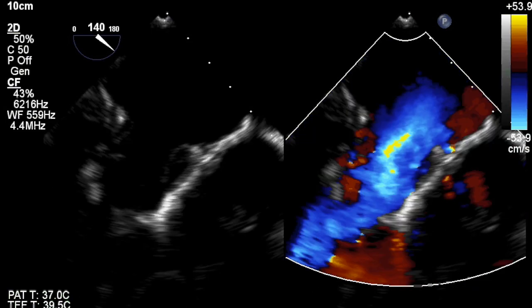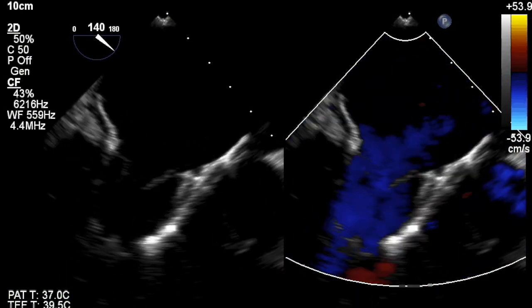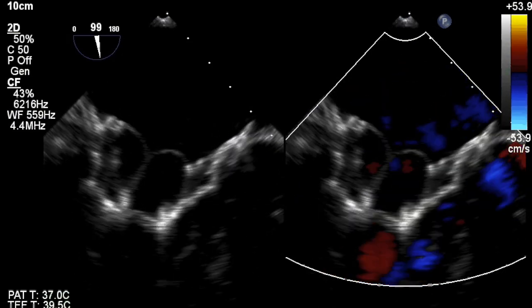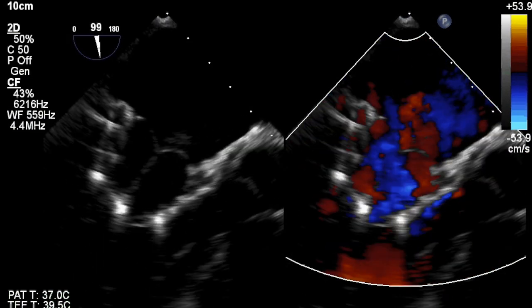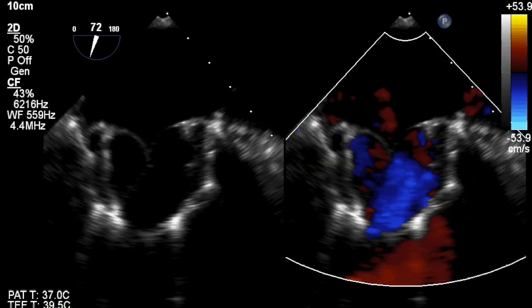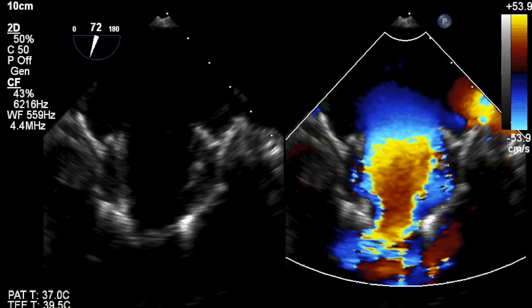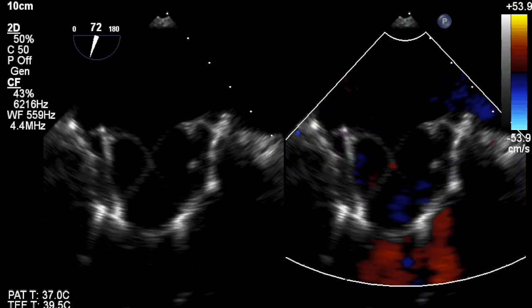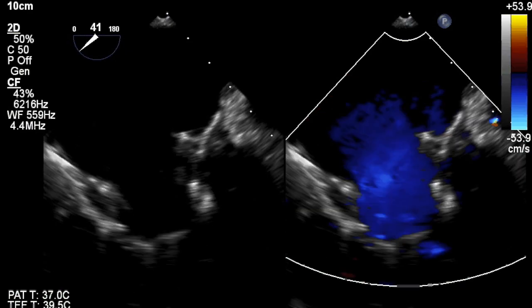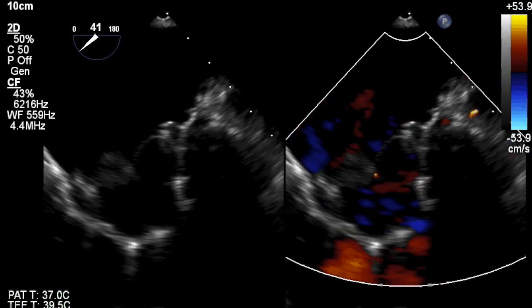During evaluation of the valve, the operators maintain a constant tether tension, holding the valve in place while completing the procedure. Color Doppler is used to evaluate for paravalvular regurgitation. The valve is observed to maintain its position and is not overriding the annulus into the left atrium or below into the left ventricle. Once valve position is confirmed, stability of the valve is maintained until the tether is attached to the apex.